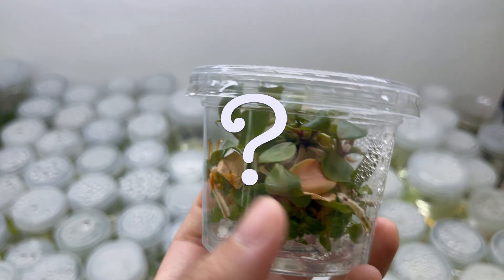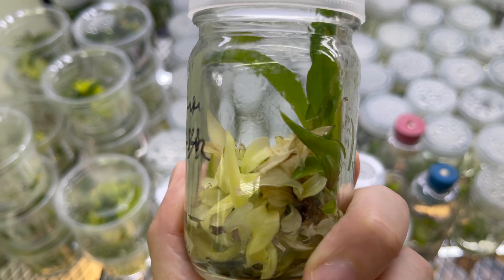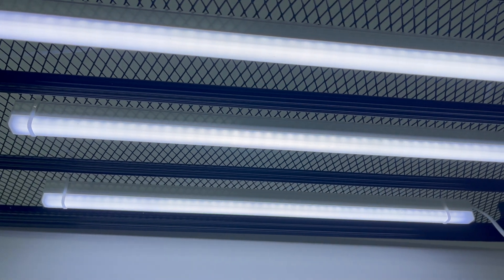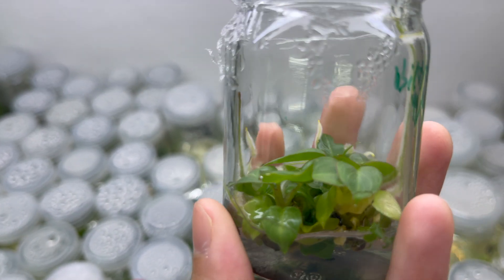Are your tissue cultures looking pale, weak, or just not growing the way they should? One of the most overlooked but most important parts of any tissue culture setup is the lighting. Without the right kind of light, even the best media and the cleanest techniques won't give you strong, healthy growth. Your cultures might survive, but they won't thrive.